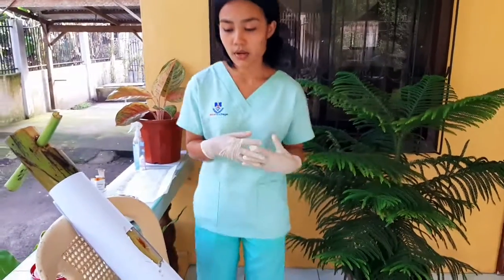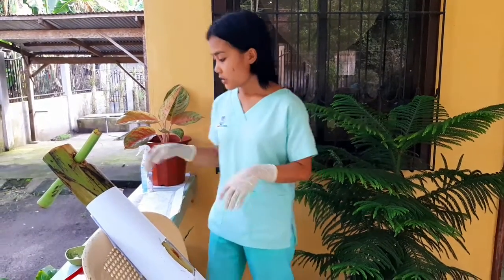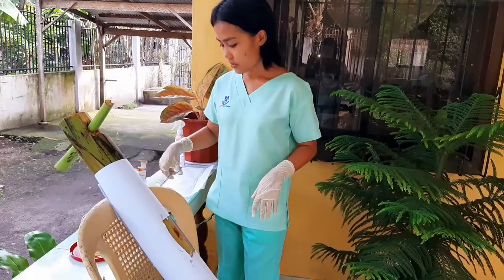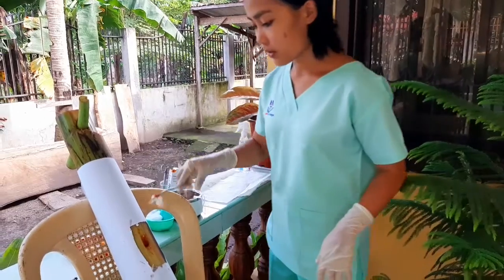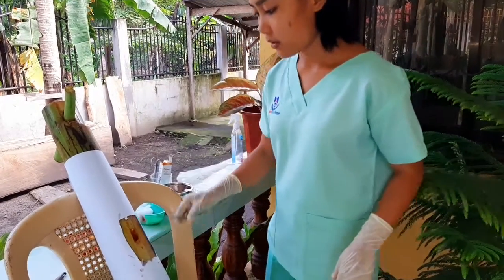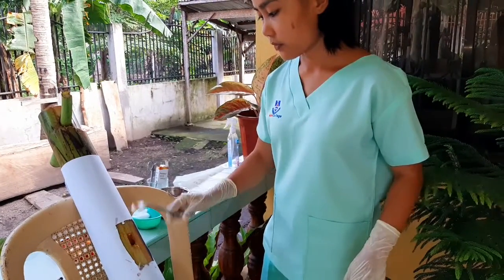Then make sure to observe the appearance of the patient's wound, and avoid contact with contaminated materials. Then clean the wound with solution. I will be using a picking forceps. From the center down, then dispose. Then to the other side, down, dispose, down, dispose, then lastly the center, then dispose.